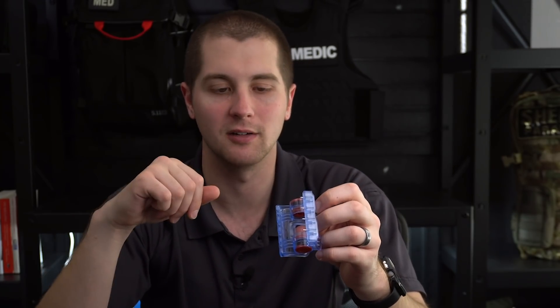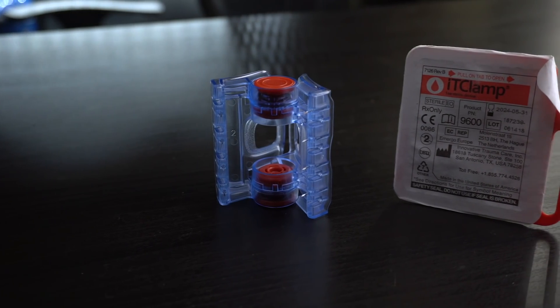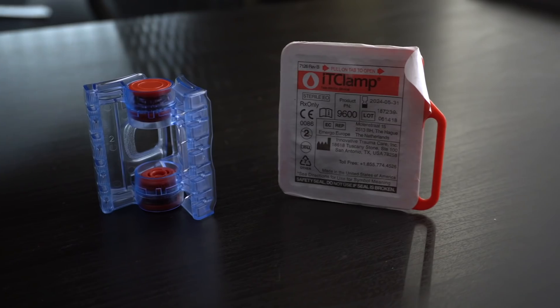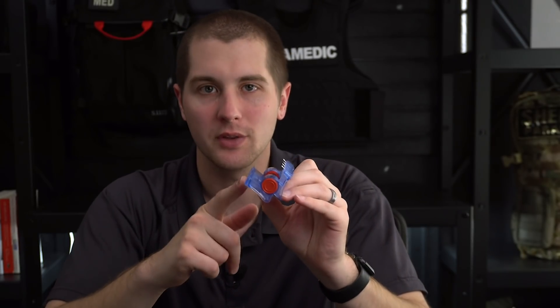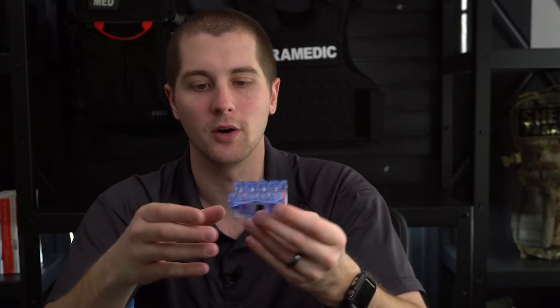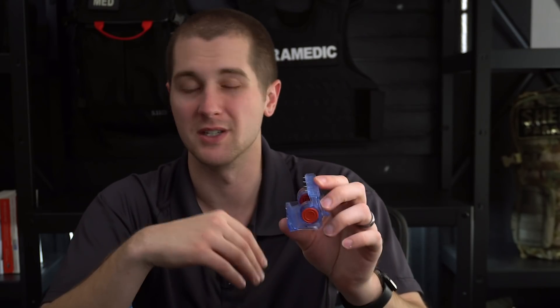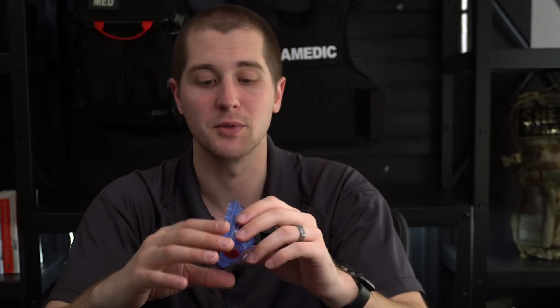They advertise this for use on the arm or the leg, but I would recommend against that. If you have massive hemorrhage on the arm or the leg, I would recommend going with a tourniquet or wound packing. Really, I think the only application for this is going to be the neck and the head. It's kind of searching for an indication otherwise — there are quicker, more effective options out there for extremity hemorrhages.